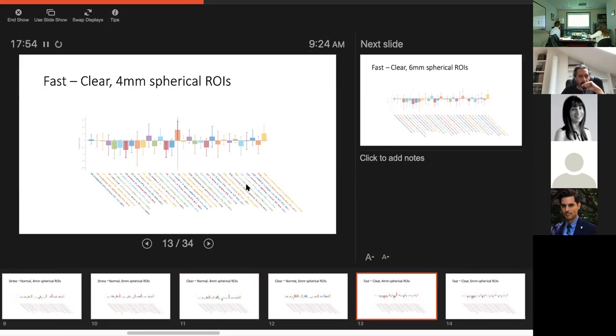So GPE goes the other way, but it's kind of hard to interpret what that means because that's an inhibitory region. So if it's more active, it would be more inhibitory of the cortex. But I don't know if it's straightforward to say what more activation means. Right, it's kind of hard to.